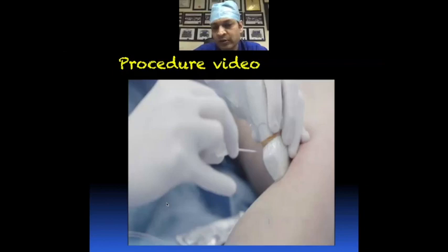We don't do any shaving. Patient walks into our OPD. We take the patient into pre-operative, change the clothes, take a consent, and we put in a cannula definitely, and the patient is on the table. Once the patient is on table, we drape the patient, clean the patient. You need to keep on talking to the patient so the patient is comfortable because it's under local anesthesia. We give 1% lignocaine, around 2 ml, wherever we want to do the puncture.